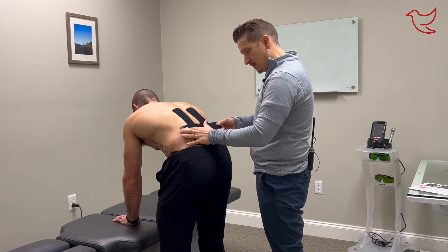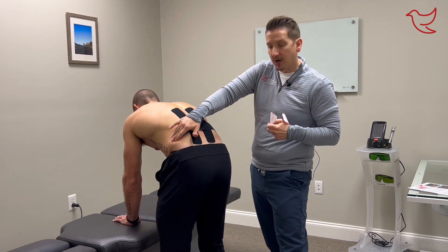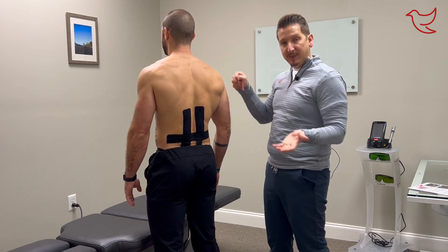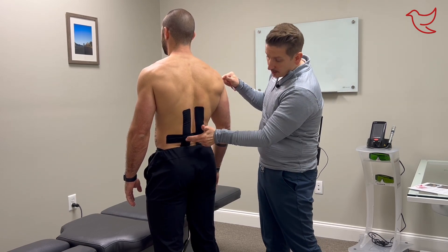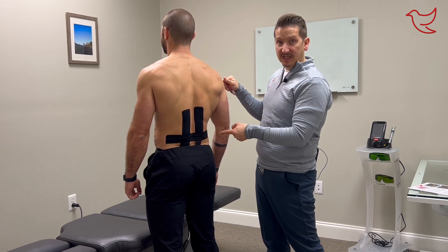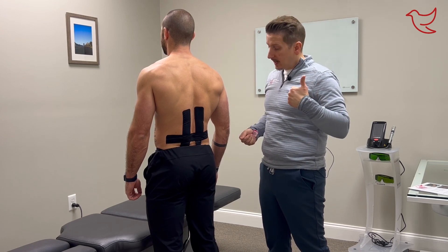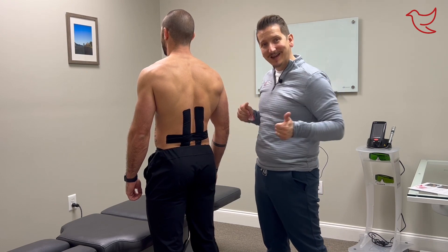Daniel, stand up for me. What you're looking for — when he was bending forward there were no ripples in the tape, it was nice and long. As soon as he stood up we got all these ripples and folds — that is exactly what you are looking for. That is a perfect tape job right there. If you have any questions about whether tape would help you, email us any of your questions. Always remember to live with passion and not pain.